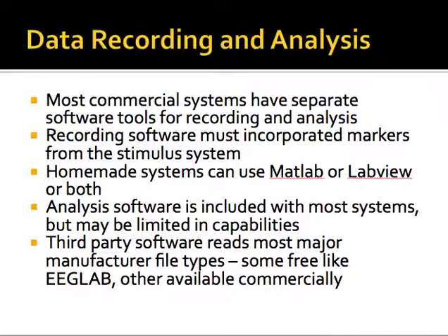Some systems even do wavelet analysis, but it's their analysis. The other problem is that unless you have forked over the additional 10 or 20K for the software development kit with many of these systems, then you don't really have access to how their algorithm is written and what it's actually doing. So it's somewhat of a black box when you run a lot of these external companies' system software, and a lot of us in engineering don't care for that. We want to know exactly what our algorithm's doing.